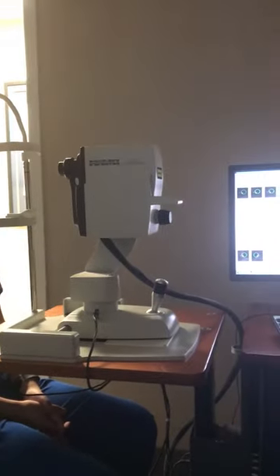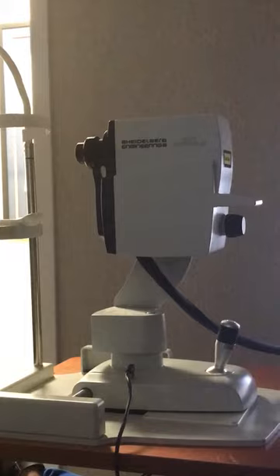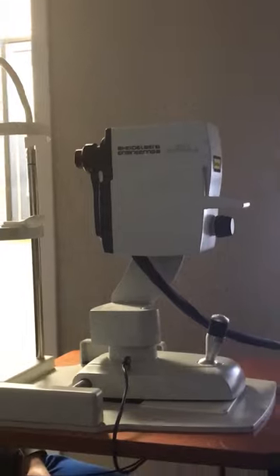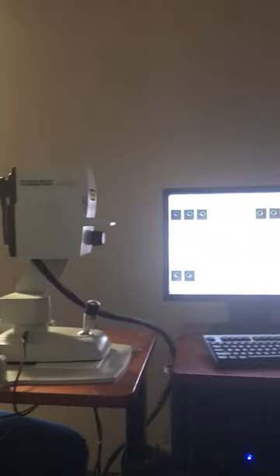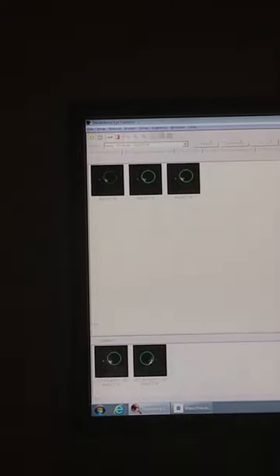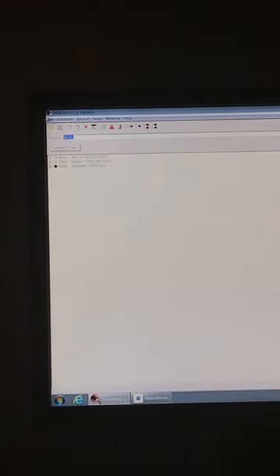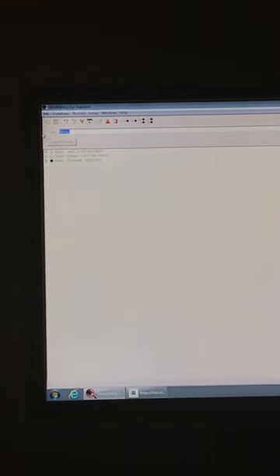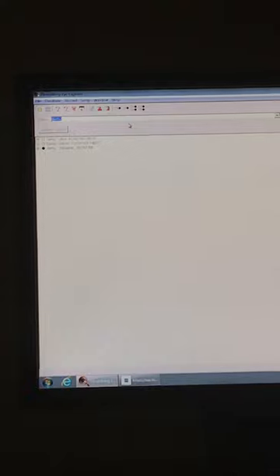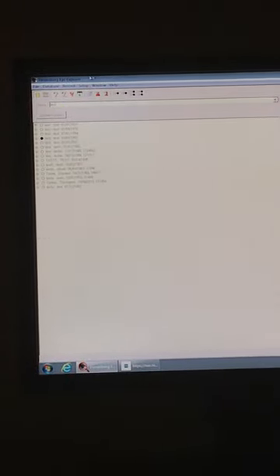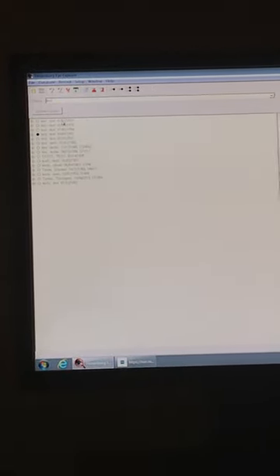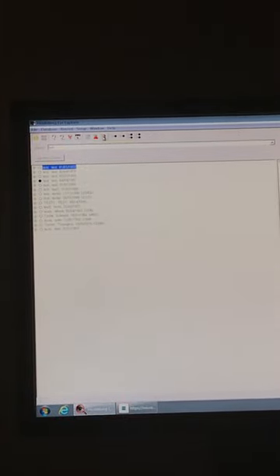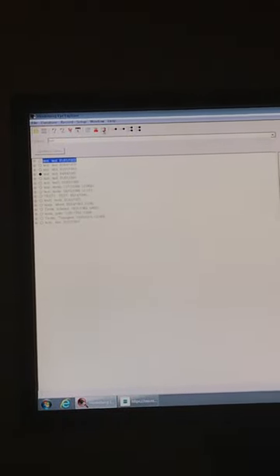This is the Heidelberg OCT. This will scan the back of the eyes. To start, we'll be going to this little icon in the top left section. We can either enter a new patient or search for an existing patient. Once you get your patient, you're going to click on it and then click on the new examination icon.